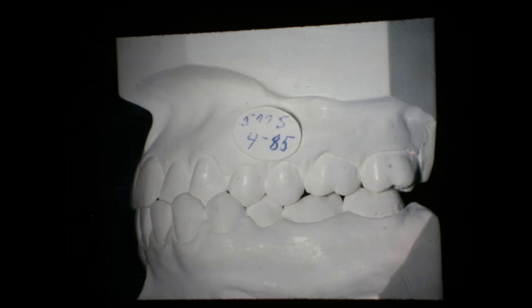Now go to the other side, and we're kind of a super Class 1 here. See, this tooth ought to kind of come up more like that. And this is a little bit further forward, not bad. Now this one is just right. It's hard to get every tooth in there. There's tooth size discrepancy, but you'll have them close, and then they wear in. But you're going to have to expand this a little bit to get it over and jump the crossbite.